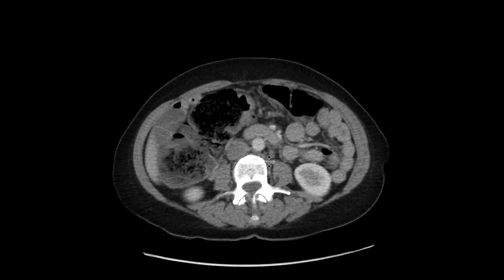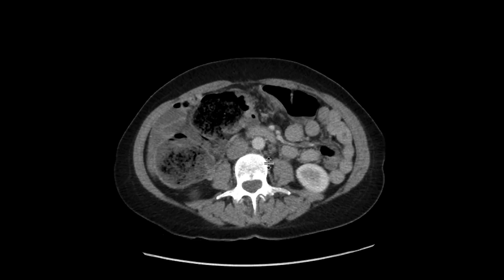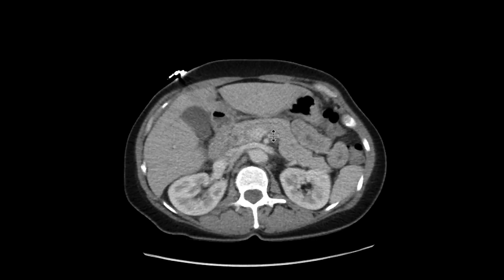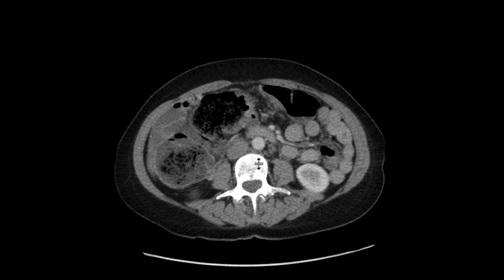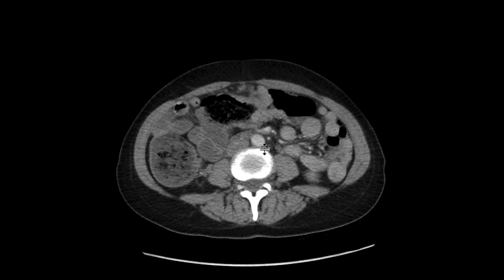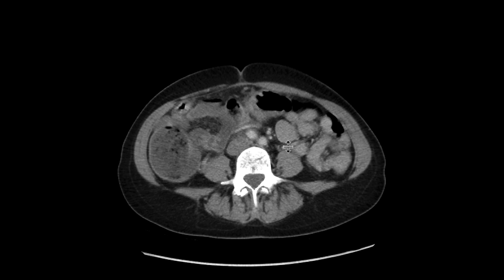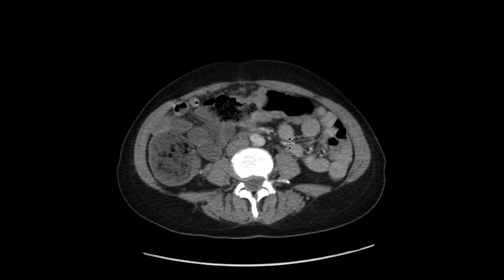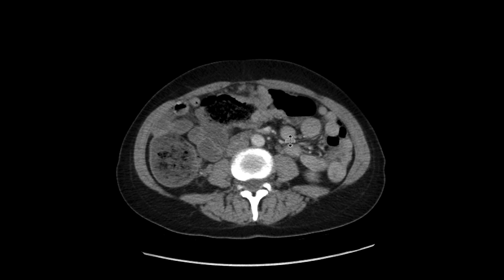Putting this all together, this is a transverse colon neoplasm with liver metastases. Looking at the transverse colon neoplasm, we can see there are all these small nodes that are also adjacent to it, and there are other clues that this is indeed a neoplasm as opposed to some sort of infectious or inflammatory insult.